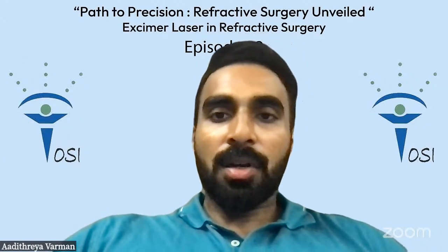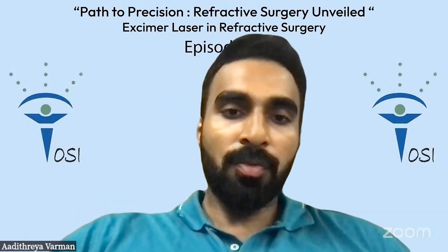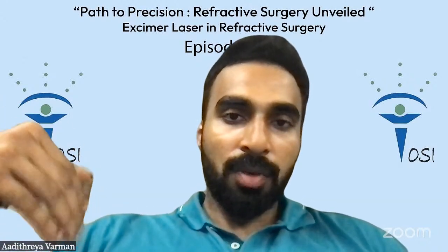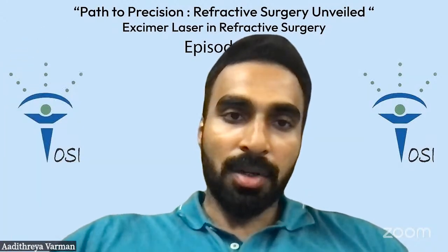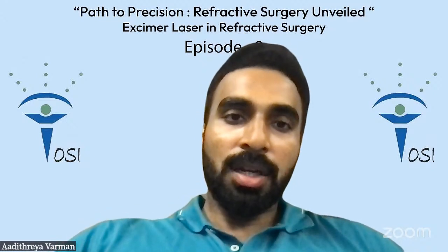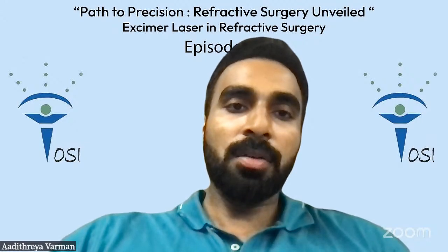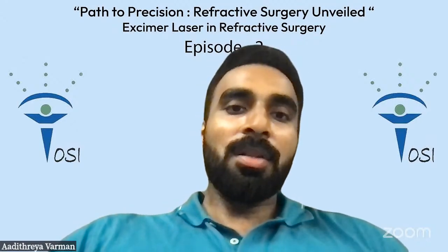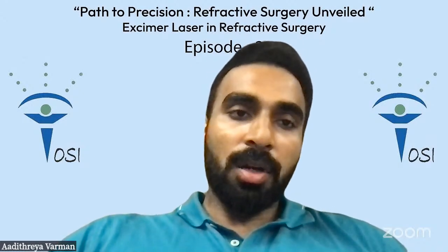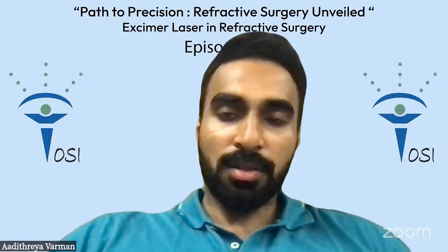The caveats here are your refraction has to be ultra precise. This thing is extremely unforgiving for even minute errors. Even if you are half a diopter off in either eye, the blend is gone. It doesn't work. That's it. You can only afford to be a quarter of a diopter off. So in my initial days, the first 10 patients I had to end up enhancing 5 of them after 3 months. But then after I started to get my algorithms right, the workup right, the nomograms right, now everybody's on target. So if you're on target, it's absolutely fantastic.